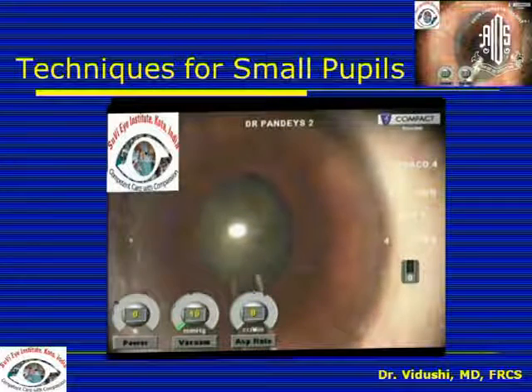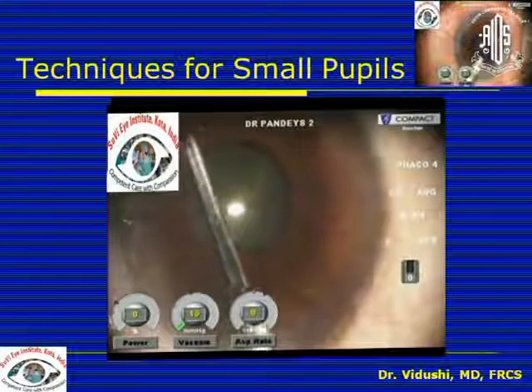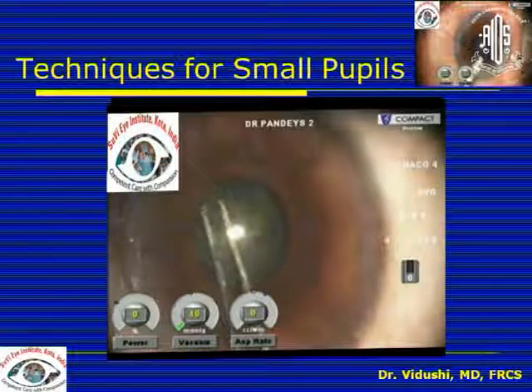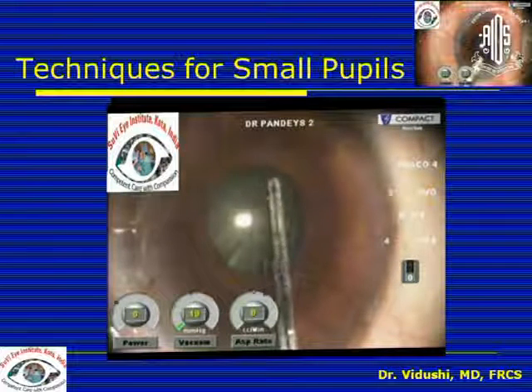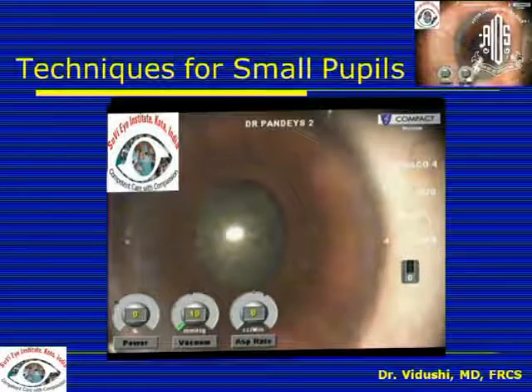As we all know, in small pupil cases the risk of every complication is increased because you perform the capsulorhexis exactly at the margin of the pupil. So your risk of having a nucleus drop, a PC rent, or vitreous prolapse, etc., increases in these cases.